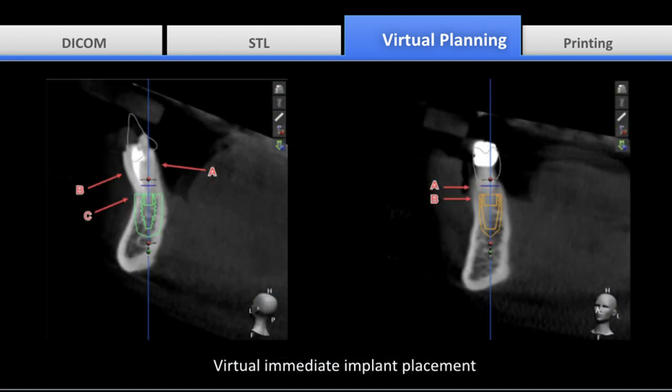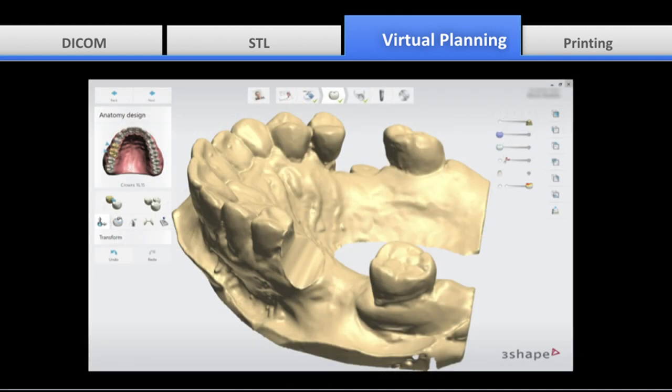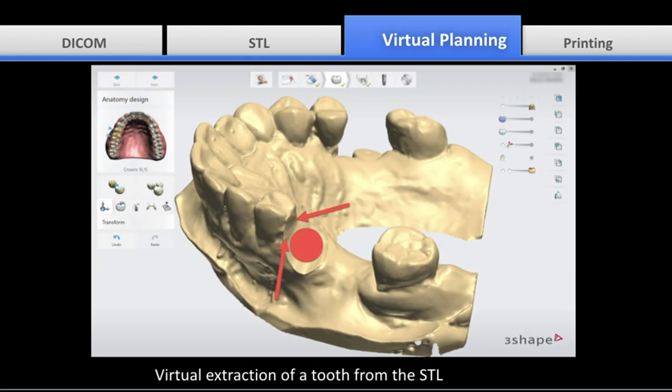Another error could happen during the virtual immediate implant placement. Sometimes the CBCT is not sharp enough to differentiate between the radiopacity representing the tooth enamel and the buccal cortical plate. So it can become difficult to know exactly where to position the head of the implant in relation to the future extraction socket. Another error could happen during virtual tooth extraction from the STL. The virtual extractions might not be 100% similar to the real extraction, resulting in an area of excess that obstructs the guide during placement.